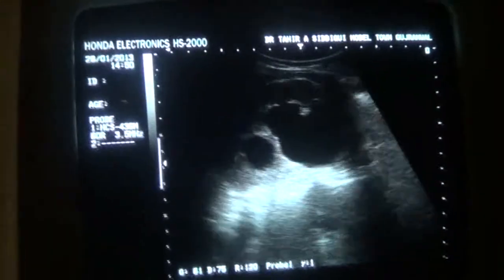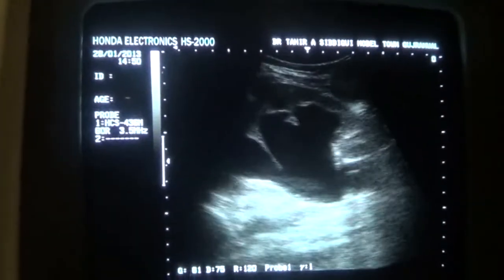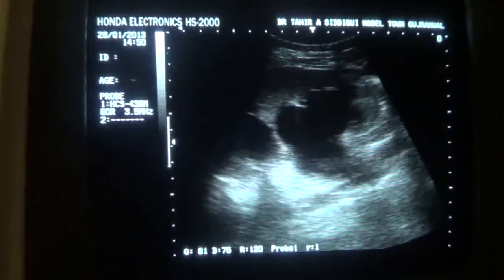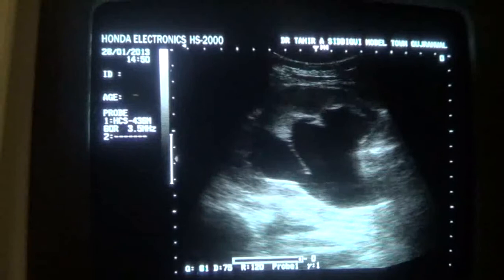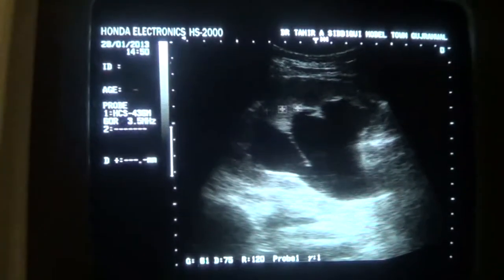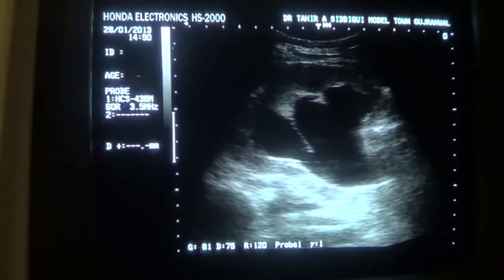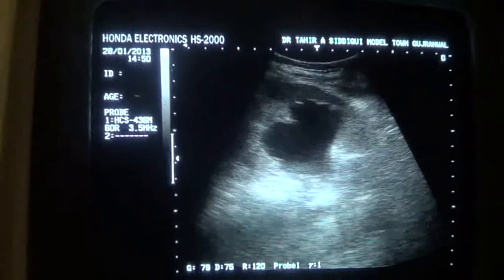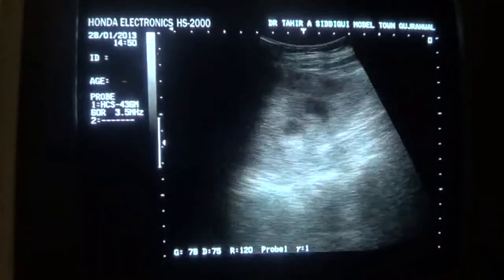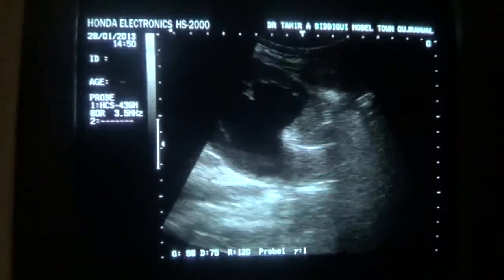Now this is called moderate to massive hydronephrosis, or moderate hydronephrosis, as you can see the cauliflower-shaped dilation of these calyces. All the calyces are dilated. The parenchymal echogenicity is slightly raised, and the corticomedullary differentiation is muffled, not that clearly visualized. So she is having parenchymal changes as well.